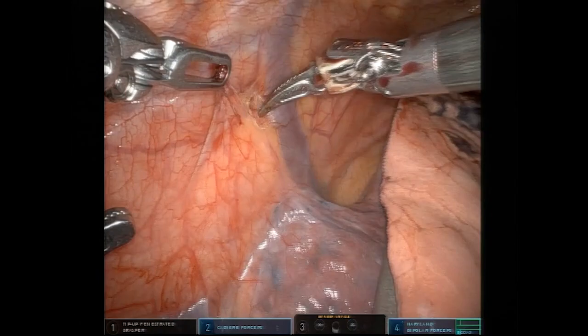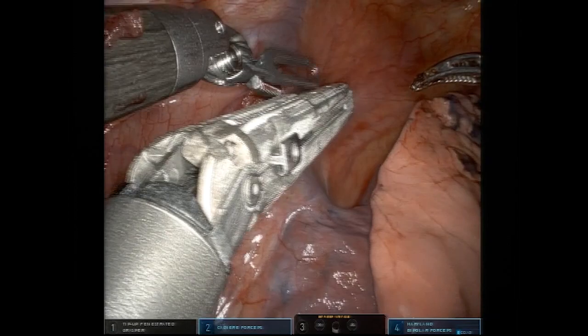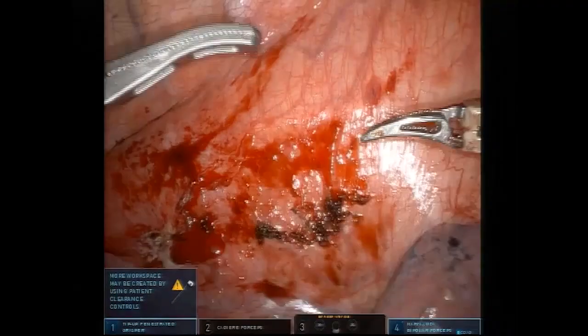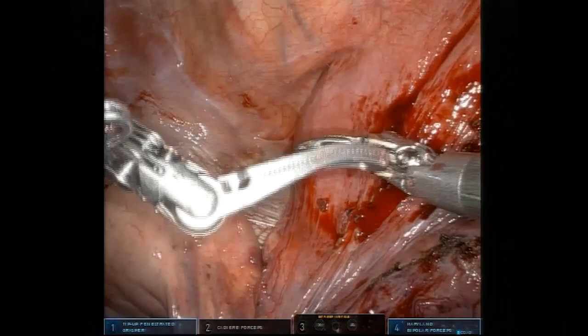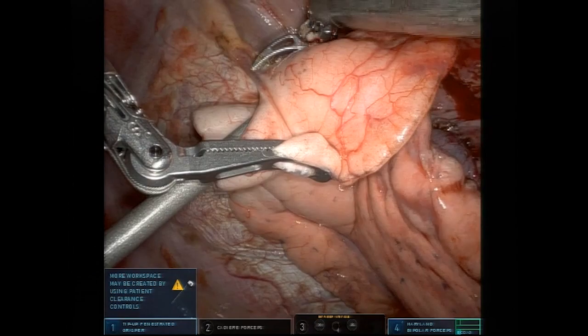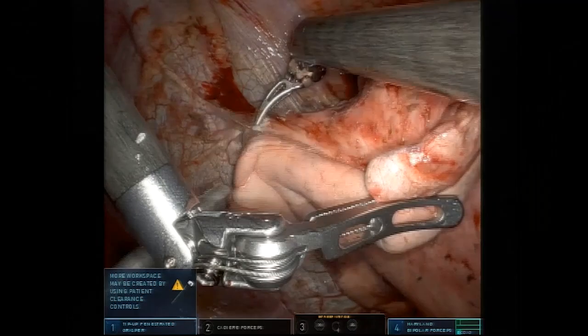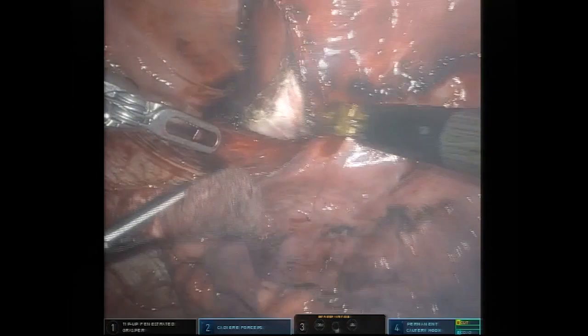Intrathoracic dissection begins with mobilization and division of the azygos vein. The dilated esophagus can be appreciated in the background. Next, the inferior pulmonary ligament is incised, including other diaphragmatic attachments to the lung. Adhesions between the lung and the dilated esophagus are taken down.